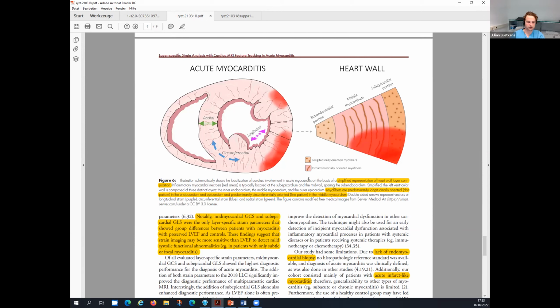Yeah, there might definitely be some limitation if you look at wall thinning in ischemic heart disease, for example, where you have a really thin wall. I think this might be difficult, but also in a thin wall you won't have any contraction anymore. But I felt very confident with the software, actually, and also the tracking was very good. Yeah, so that's good that there's good software out there to help with that.